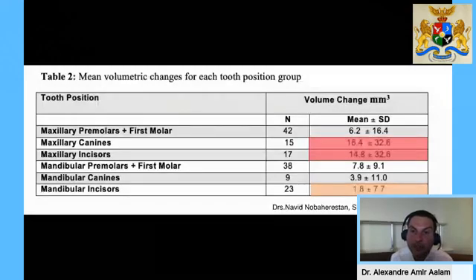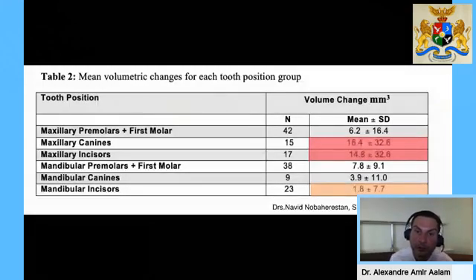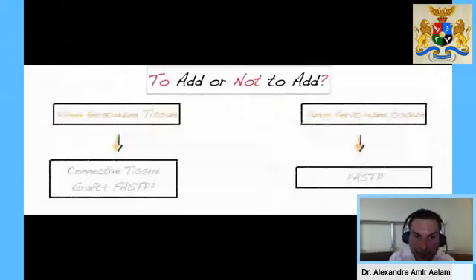We usually have a band of keratinized tissue that is present, and for these reasons, mixing it with the PRF, we're able to get a better clinical outcome and avoid the utilization of connective tissue graft, versus the mandibular incisor teeth, where we have the least amount of keratinized tissue, where the surgical site is much more hostile, much more difficult to work with, and the gains were much more modest in that area.